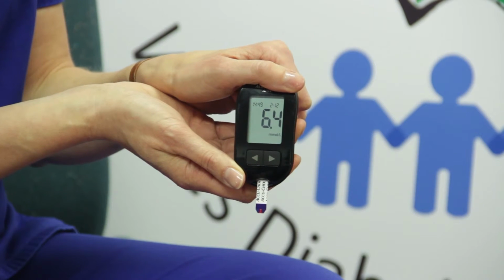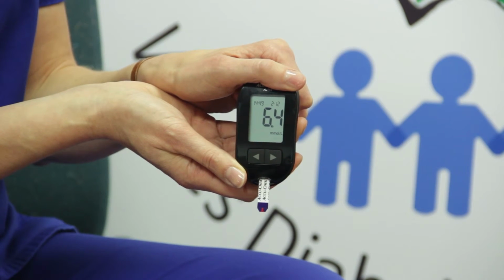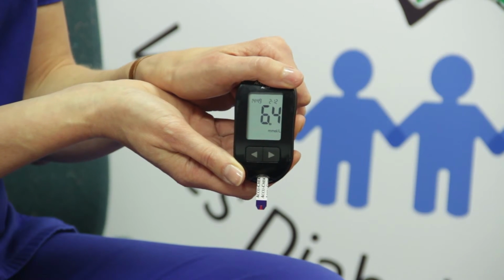Within about 5 seconds, the blood glucose reading will be displayed on the machine. It's really important that an adult looks at the screen and you don't rely on the child telling you what the blood glucose reading is. This will mean that as an adult, if you've seen the machine, you will know what is the appropriate course of action to take.